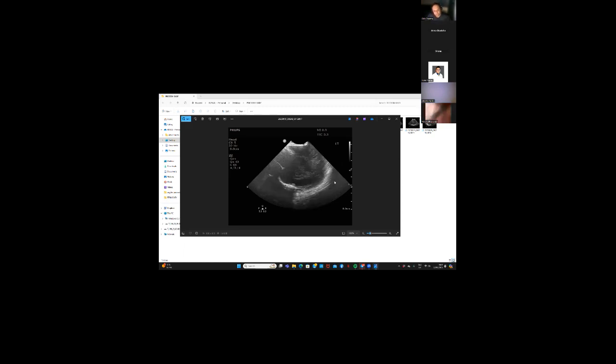And this is the outermost, where the parietal and the temporal are. Then this one was the mastoid I tried for this baby. This is the reverse mastoid that you're getting, a little bit tricky to interpret at this particular point. I can definitely see the brain stem in the middle. This part is the cerebellum.